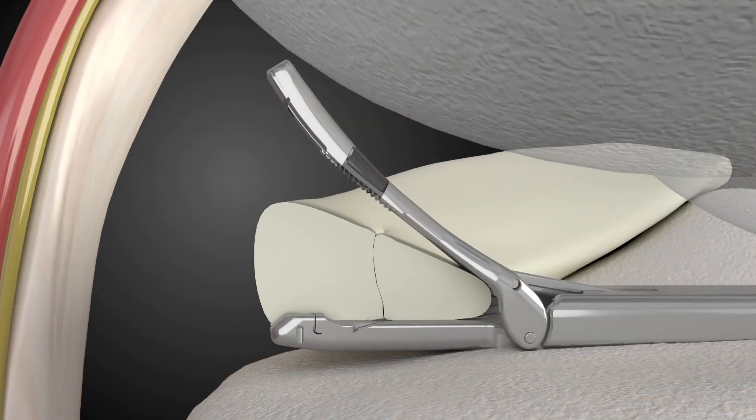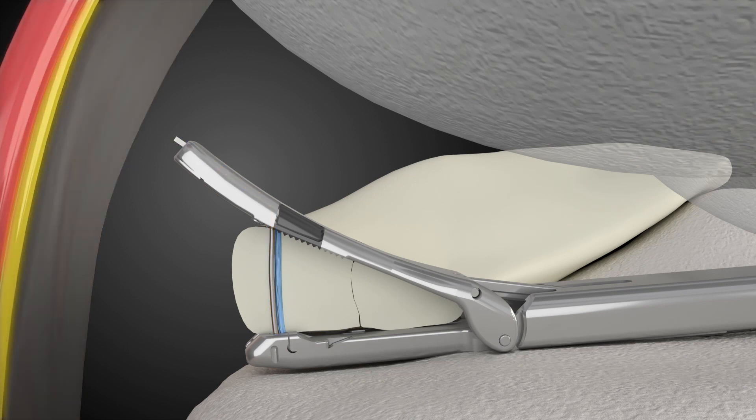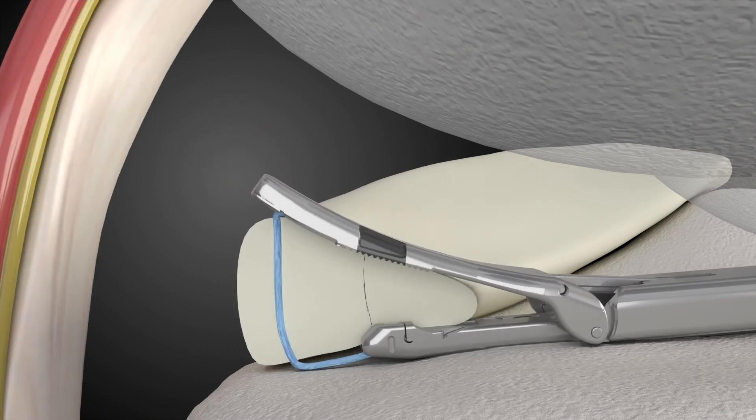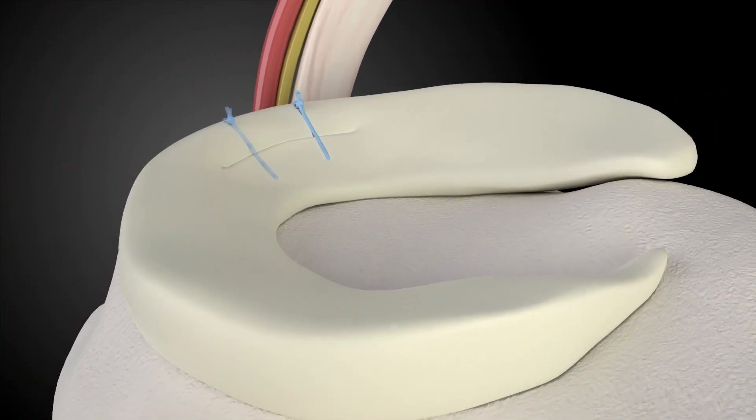One of the things I like the most about the Pro is the textured surface on the upper and lower jaws. Having used it in practice, the texture does allow one to grip the meniscus with much greater effectiveness, allowing the device to stay in position to place the sutures more precisely.